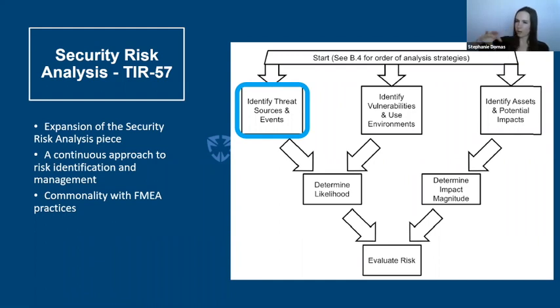But if you're trying to figure out where in the larger minutia it is, I'm proposing this is where it is. It's in that security risk analysis piece, and it's in this identify threat sources and events. So it's an expansion of your security risk analysis. For those familiar with things like FMEAs, you may find some commonality, but with a cybersecurity perspective. And even though it's done early on in the life cycle, ideally it's one of these organic documents that keeps growing and living with the system.